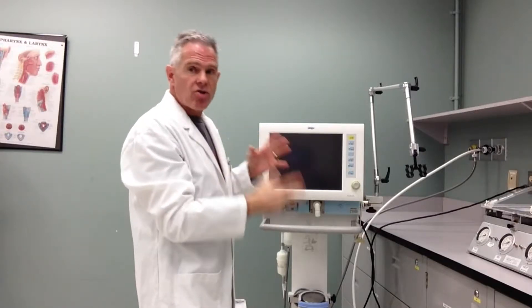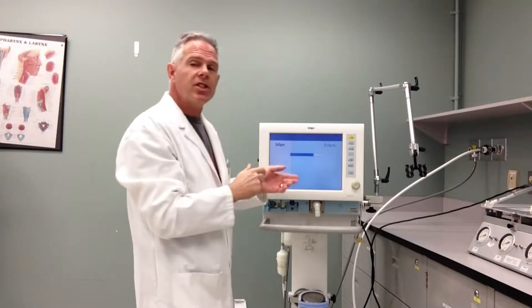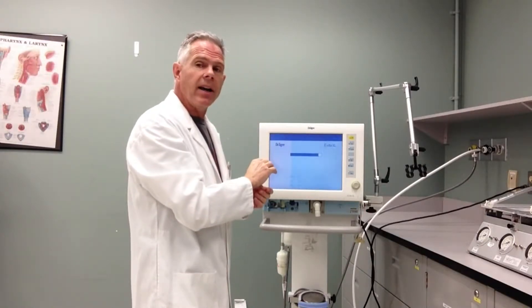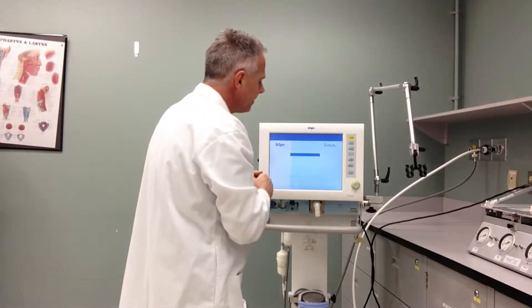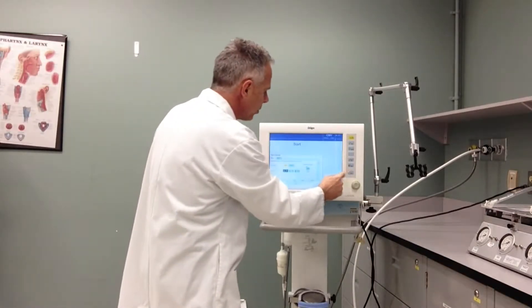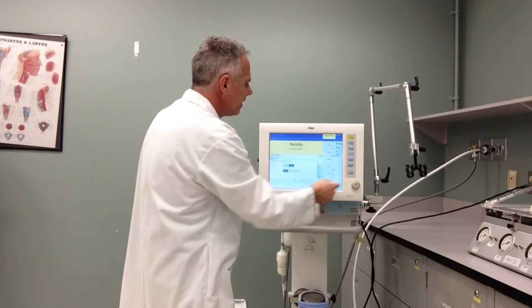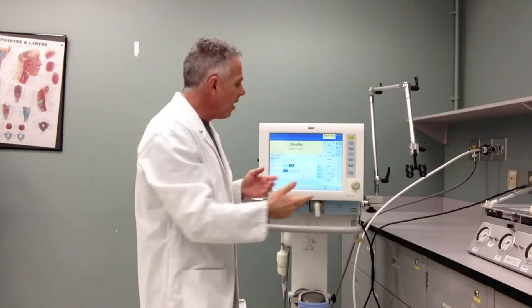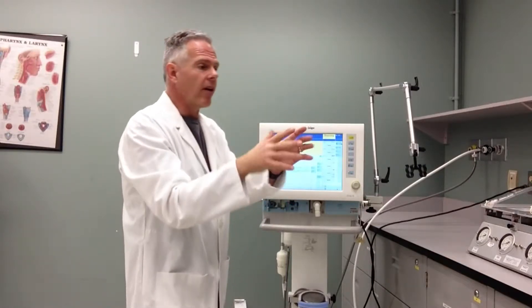This ventilator does a quick electronic checkout as we turn it on, and once it's finished that I'm going to put it into standby. There I can set up all the patient settings and put it through its checkout. So let's just put the ventilator in standby. The ventilator is in standby mode now. I can get ready to do my device check, but before I do that I'm going to put the actual circuit on there.